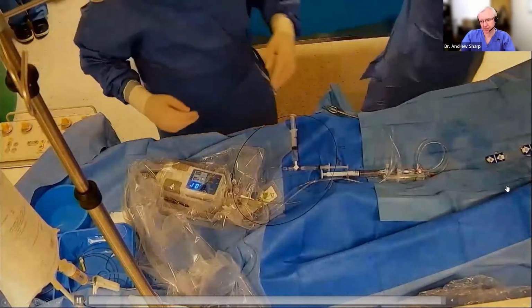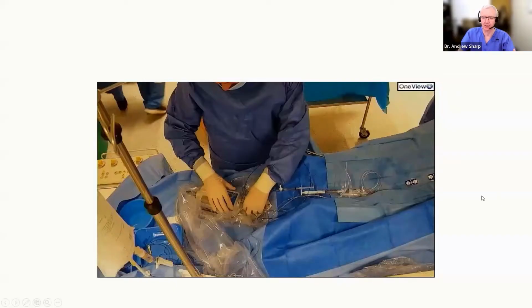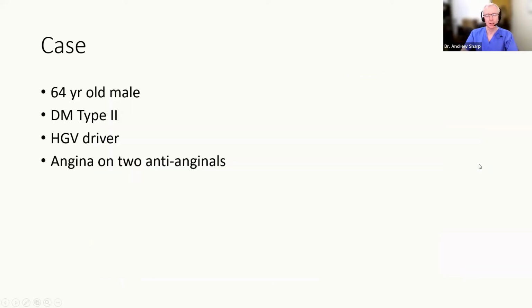As with all things, simplicity comes from practice, and it helps if you're doing this on a regular basis, so that you and your team are used to prepping the device. Well, you can see there that's real time, although I think it looks like I've sped it up artificially. I haven't. That's what it's like doing it in real time. So I'm now going on to the case that we did today.